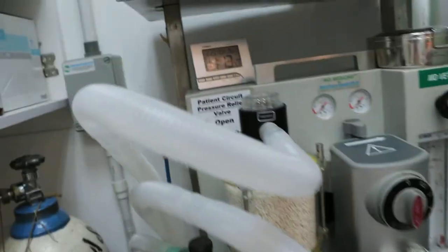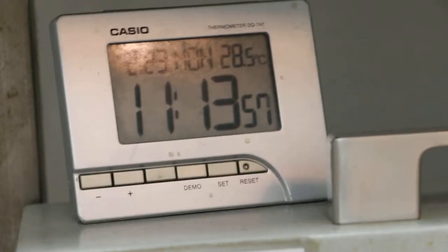The time now is, as you can see, 11:13 am, February 24, 2015. The dog is still sleeping.